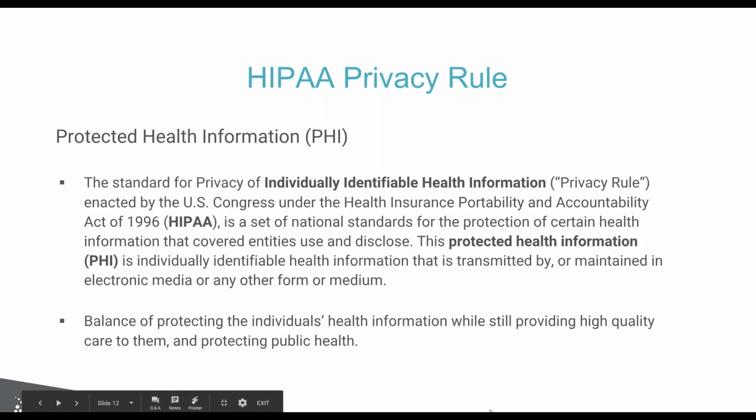So I'm just going to go ahead and give you the nuts and bolts regarding our de-identification process, and give you some history if you're new to this, or if you have half information and so on. So all the de-identification efforts really stem from the HIPAA privacy rule that most of you, I'm sure, have gone through HIPAA training. It's just a staple of our business, right?